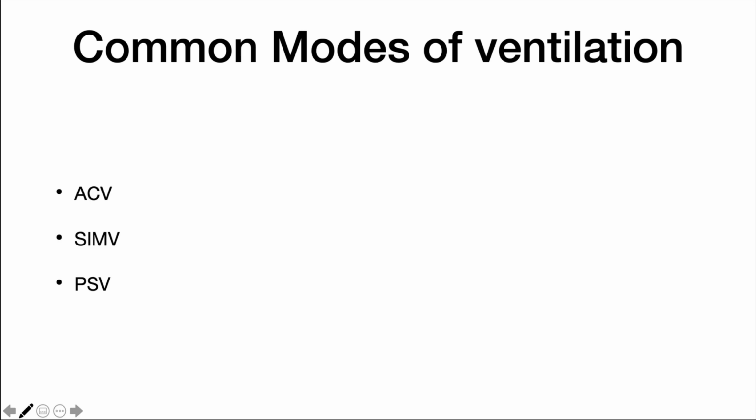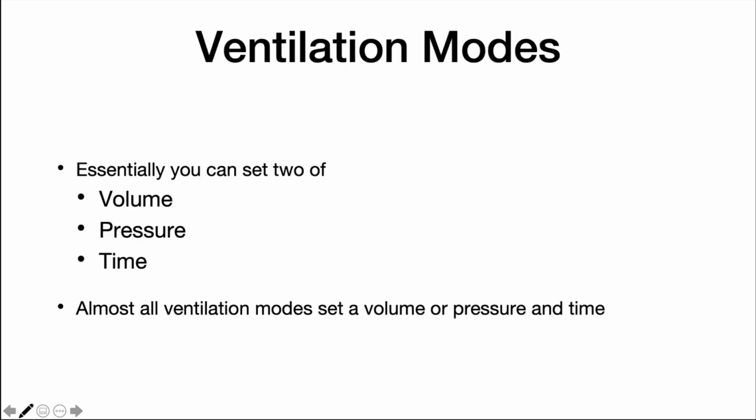Control mode ventilation is the original mode of ventilation. In CMV, the patient receives a positive pressure breath at a set rate without the ability to influence how it's delivered. By choosing either volume or pressure ventilation, we can determine the control variable that is used to deliver the gas flow to the patient. Control variables are independent variables. In volume controlled ventilation, for example, the volume selected is constant and independent of what happens to the pressure when the patient's lung characteristics change, or when the patient's effort changes.